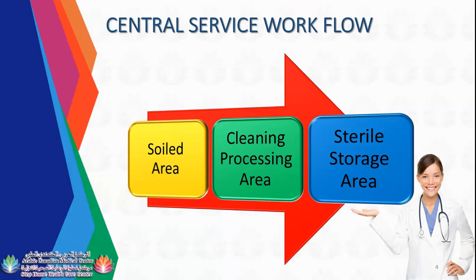processing area. So you are doing manual brushing and then mechanical cleaning process. Once you process your instruments, you go from soiled to sterile storage. That's the workflow. But if you clean your environment, once you clean your CSSD room, because the CSSD technician is the first hand responsible for cleaning the CSSD room, it's a different workflow. If you're cleaning the CSSD room, you need to start from the sterile storage area to the soiled area, which is the dirtiest area.